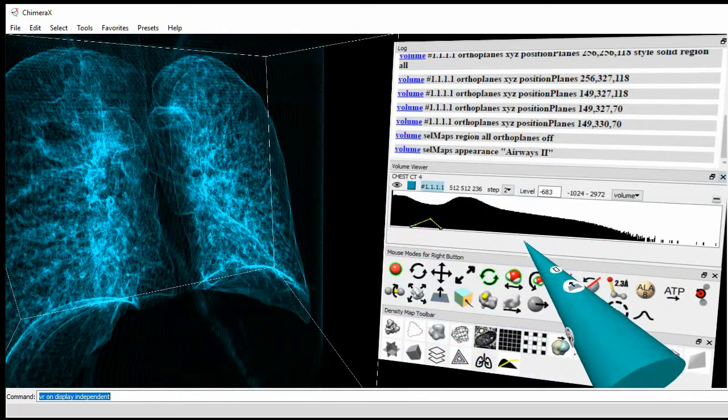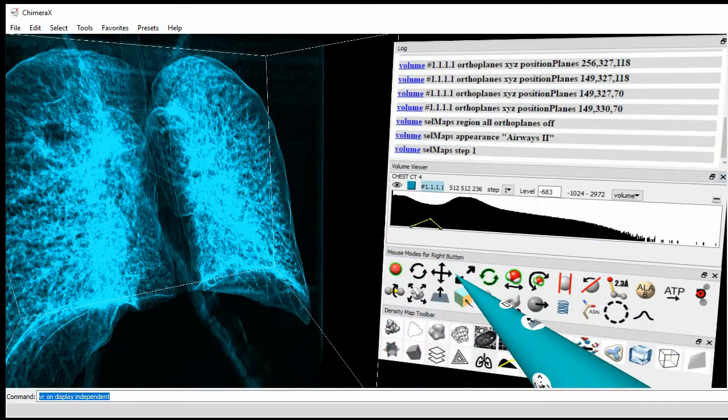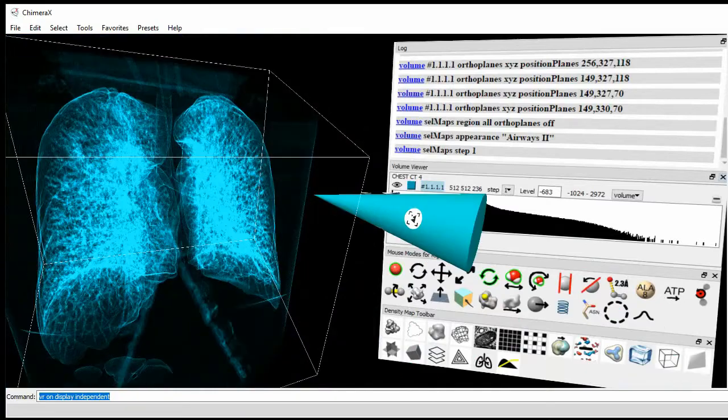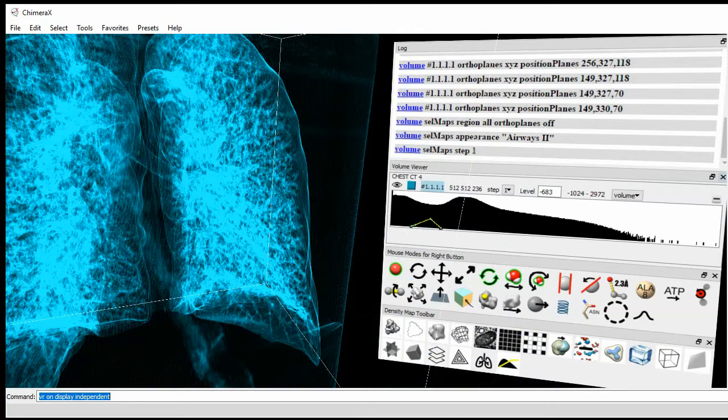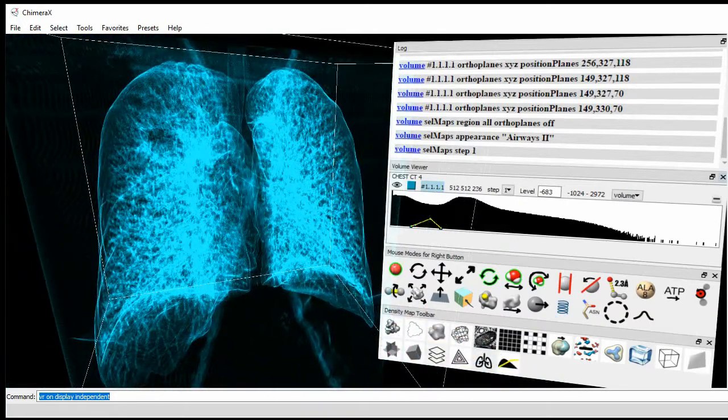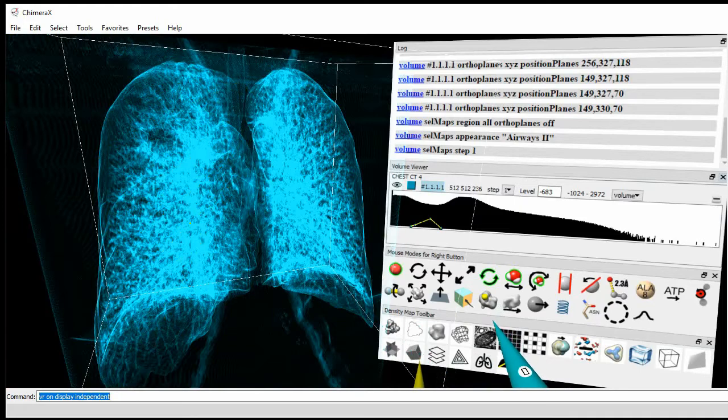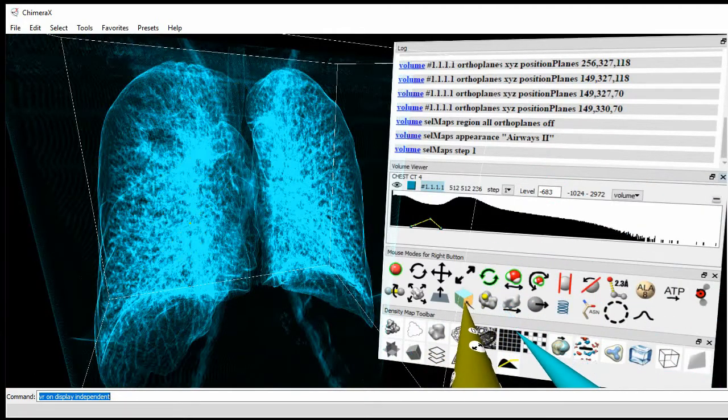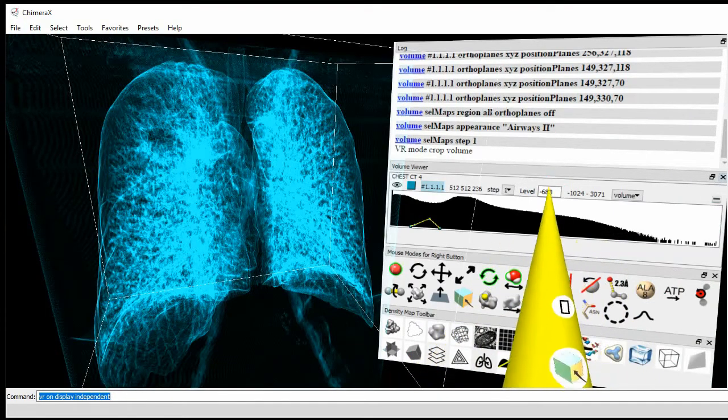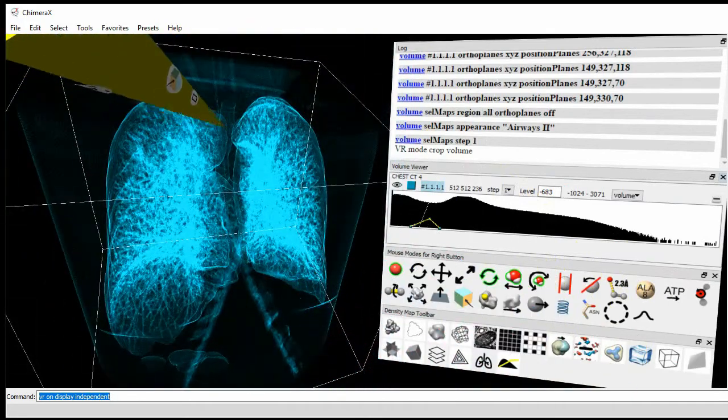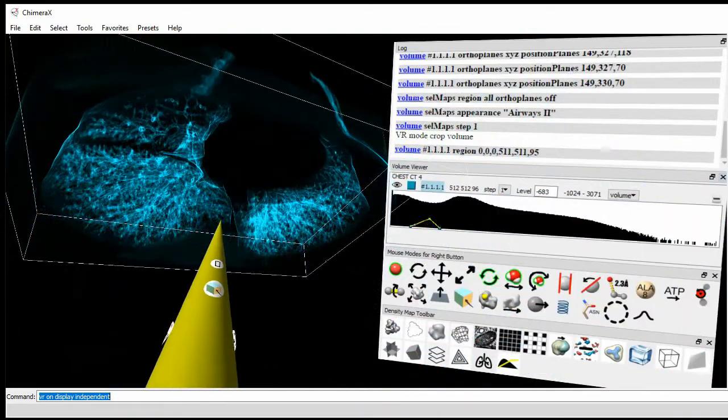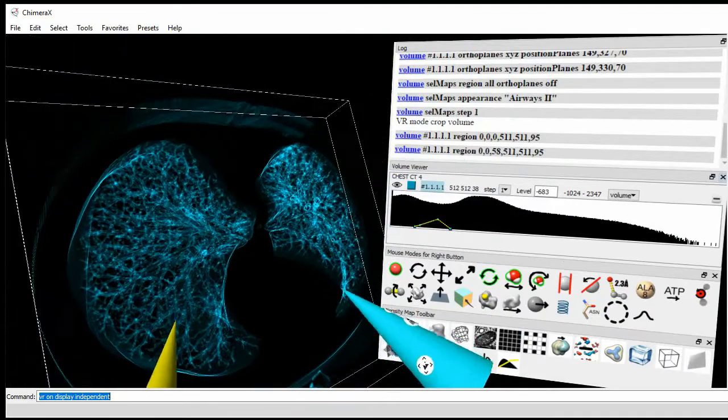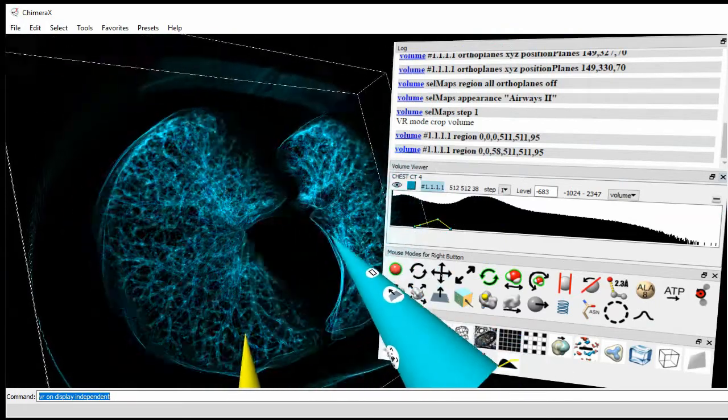A problem looking at this is that airways are very complicated and overlapped, so it's hard to see much of anything in this. What I'd like to do is reduce the display and look at just a slab. To do that, I'm going to use another mode. It's this blue cube that will allow me to crop the data. I'm going to push with the thumb button, and I see the icon has appeared. I can now click the button on a face, and I can crop the data to a smaller size so that I'm looking at just a slab of the data. Once I have that slab, I can go back to moving the planes, and it will move the whole slab.